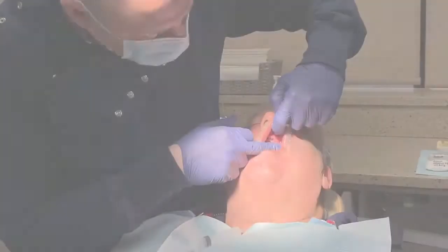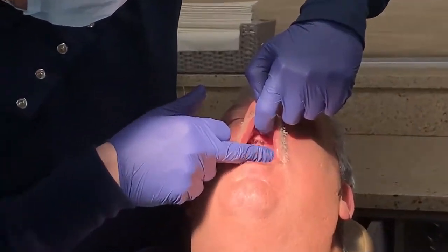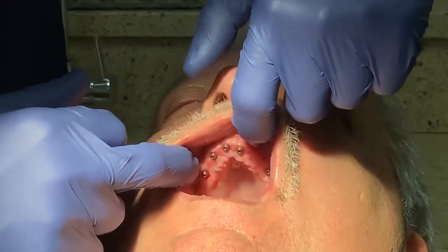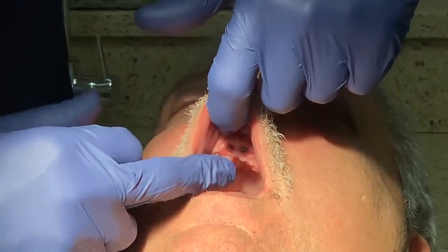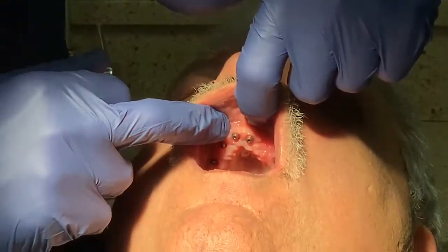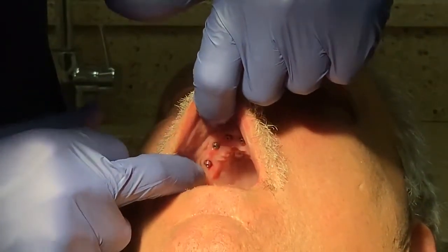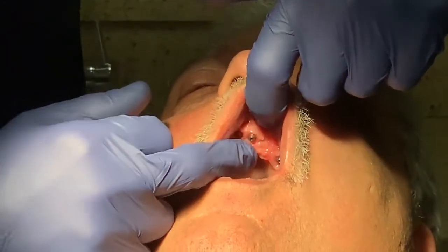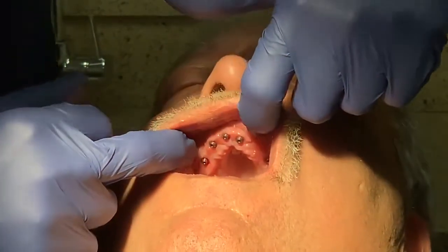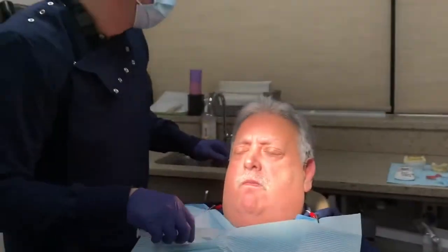Okay, great. Thank you. This is what you really want to see when you take off the provisional prosthesis, where if you look, the tissue is level and even, and the pontic areas are relatively flat. So you're not going to have a ridge lap after in your definitive prosthesis. And what we also see, which is great, and sometimes you don't always see this, is that the multi-unit platform is right at the gingival level, maybe 0.5 millimeter or 1 millimeter subgingival, which is nice. So you don't have the collar of the multi-unit sticking out, and it's also right in line with the soft tissue. So the prosthesis is going to be nice and hygienic when it's fabricated.